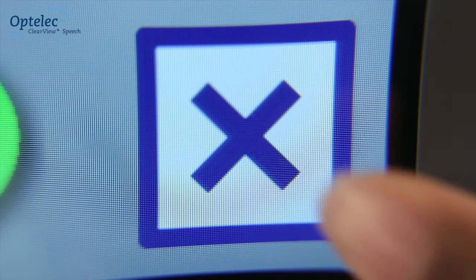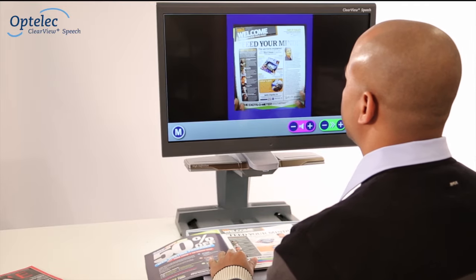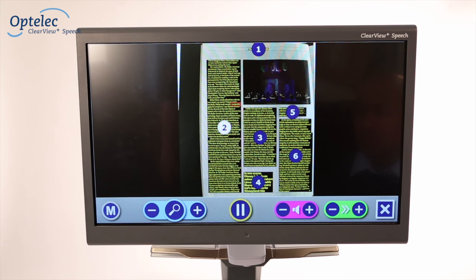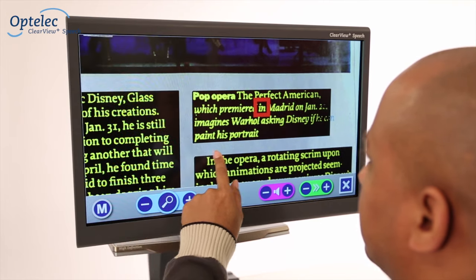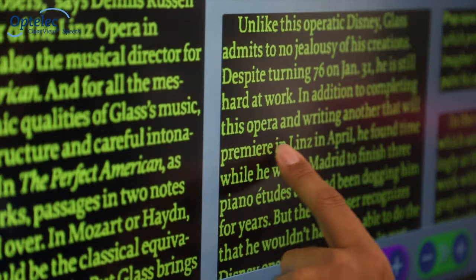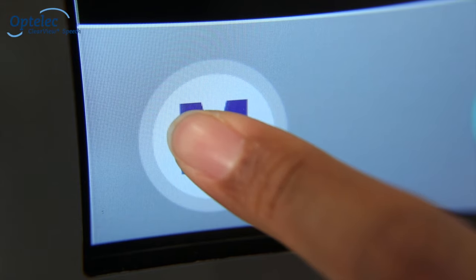Simply press and hold the X button. Place a new document onto the reading table and tap the screen once again. Enjoy instant point-and-read navigation through your document by simply swiping your finger across the screen.